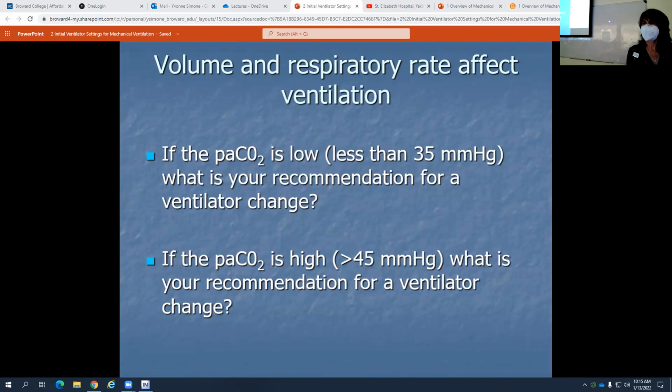What is the tidal volume? What should the tidal volume be? Well, no, I know what the tidal volume should be by the calculation, but let's say you ask us, what would your recommendation be for ventilator change, given the CO2 is high? Would you tell us what the tidal volume is set at, so we know whether we should change that or the respiratory rate?